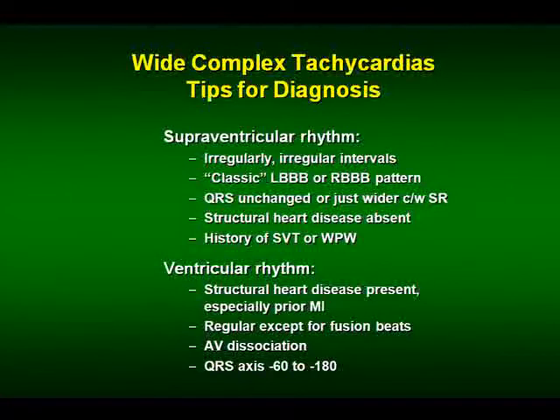So let's talk about wide complex tachycardias. How do we know it's ventricular tachycardia? And there's a couple of rules. People will go through all these complex ECG rules, what's the direction of the R prime in V1 and the ratio of R to S, and I can never remember those rules. So I go with fairly simple rules.